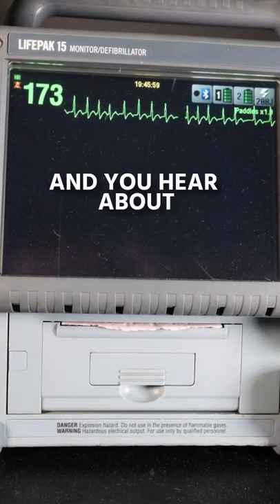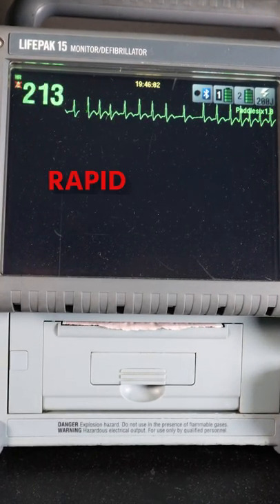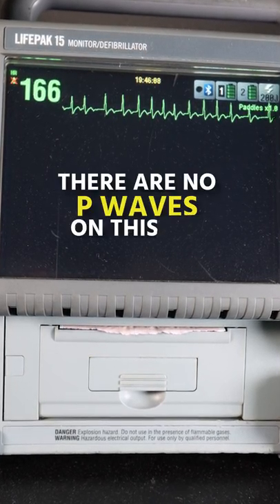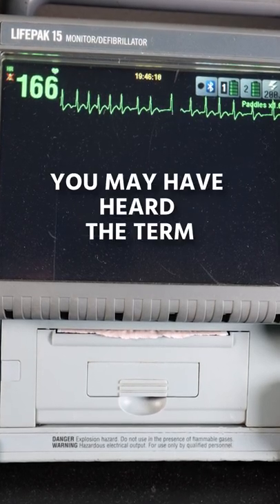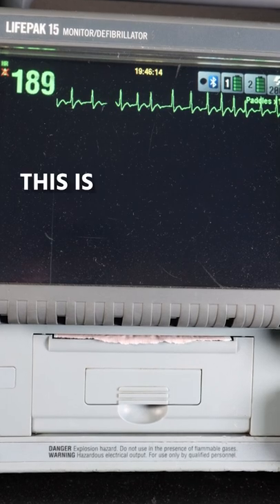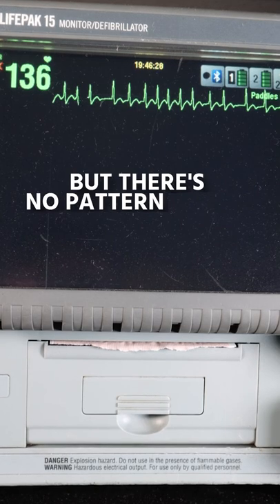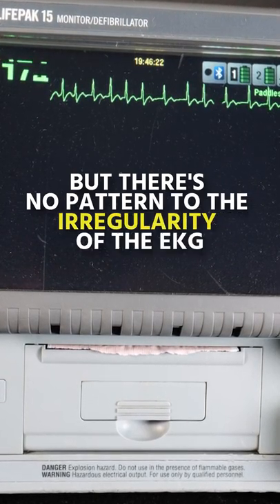So you're in class and you hear about rapid AFib — rapid atrial fibrillation. You're looking at it right now. We can see here there's no P-waves on this EKG. You may have heard the term 'irregularly irregular.' This is what you're looking at. This rhythm is irregular, but there's no pattern to the irregularity of the EKG.